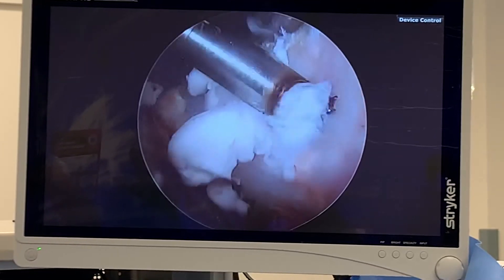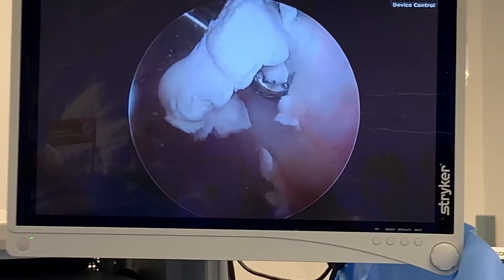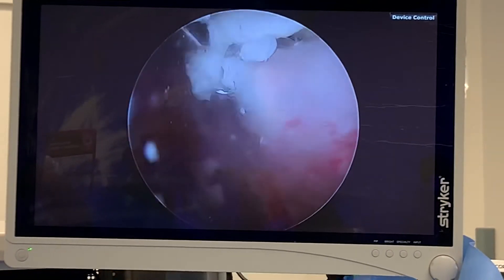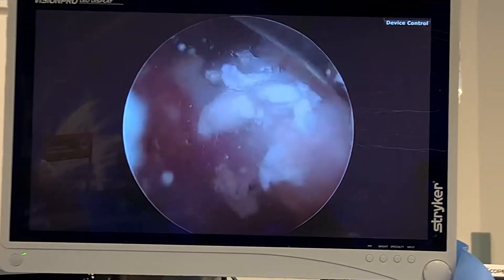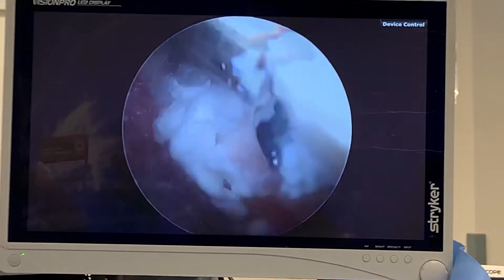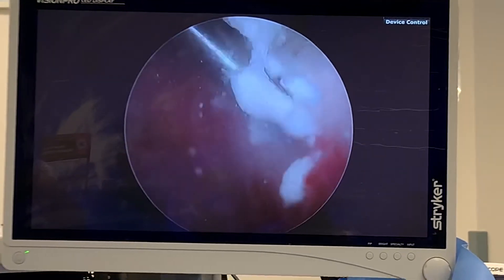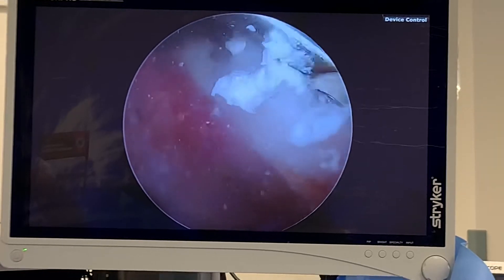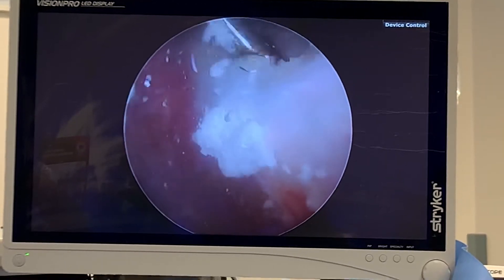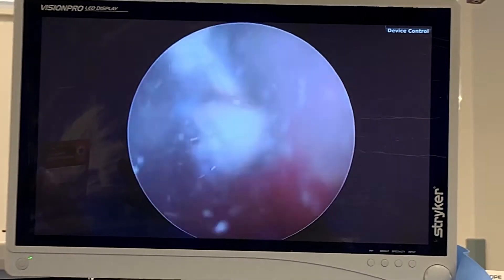And it'll destroy the rotator cuff. So I'm going to try to just squeeze it out and then repair the rotator cuff. This hurts — this is why this patient's pain was greater than I expected with a rotator cuff. Calcific tendonitis is extremely painful. When one of these little pieces of calcium breaks off, it fills the joint — or the subacromial space — with snow. It's extremely inflammatory. I tell patients it's like battery acid, so very painful.